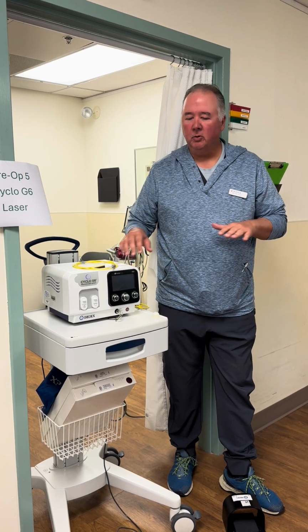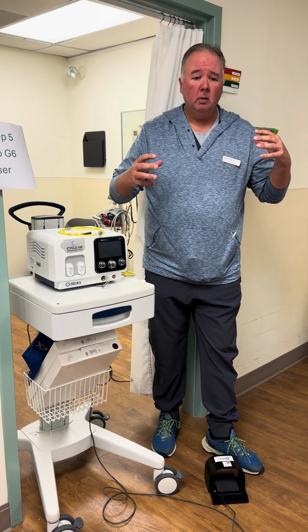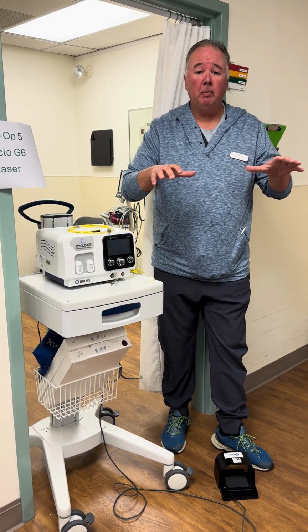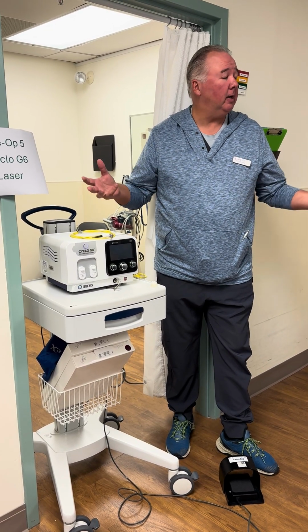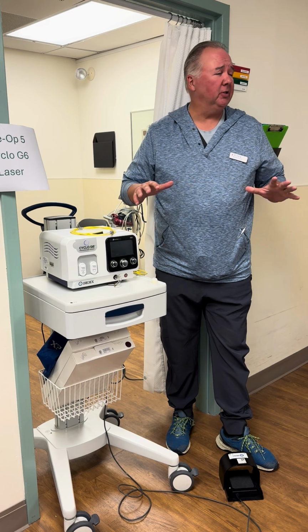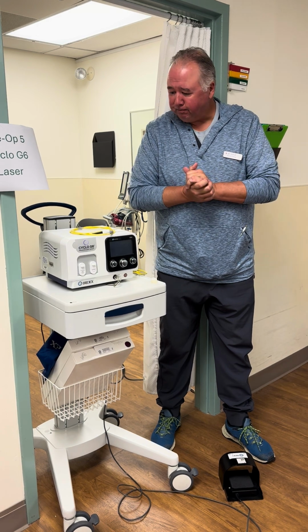So what the micropulse is doing is spreading that energy across the ciliary body, which is what is producing the fluid inside the eye that's making the pressure increase. What it's doing is stimulating that ciliary body to provide more flow so that the patient's eye pressure is lower. The G probe, what it's actually doing is destroying the ciliary body. So it's a last ditch effort to lower the pressure.